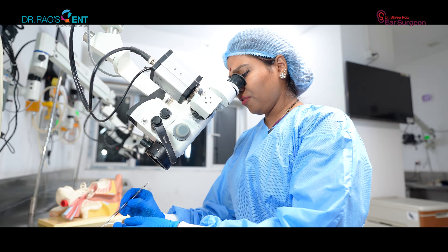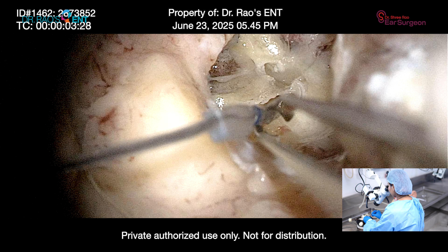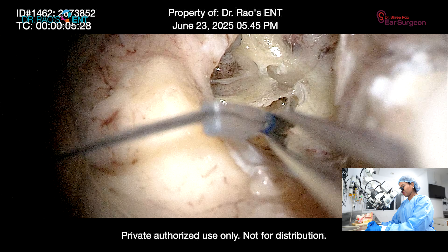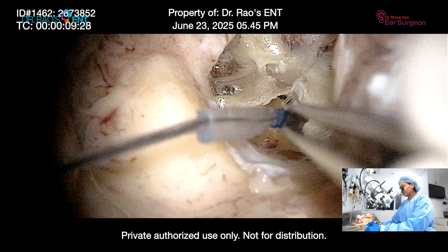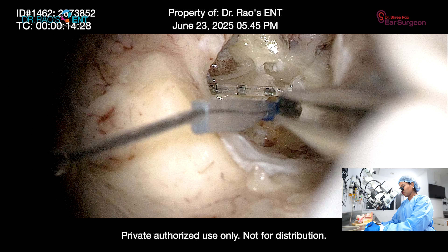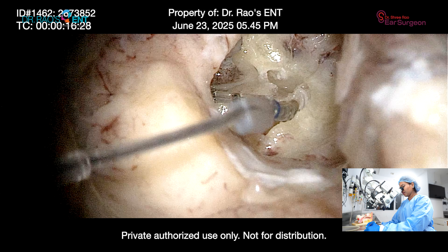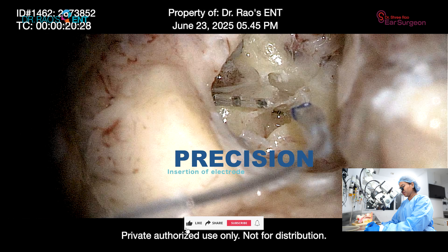Let me show you how. If you look, this is how stable my hands are — there is literally no tremor, nothing. The electrode very clearly, without any resistance, goes in. And this is how an ideal insertion should be.